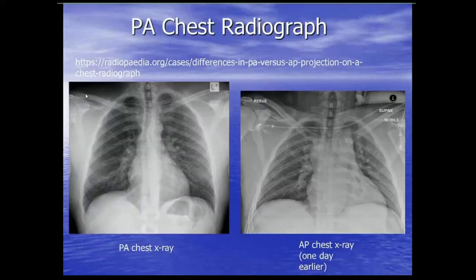Here's a nice example. On a PA chest radiograph, the heart size looks normal and the mediastinal silhouette looks normal. On an AP radiograph taken one day earlier, the heart looks borderline enlarged and the mediastinal silhouette looks a little big. This proves the point — PA views are much better.